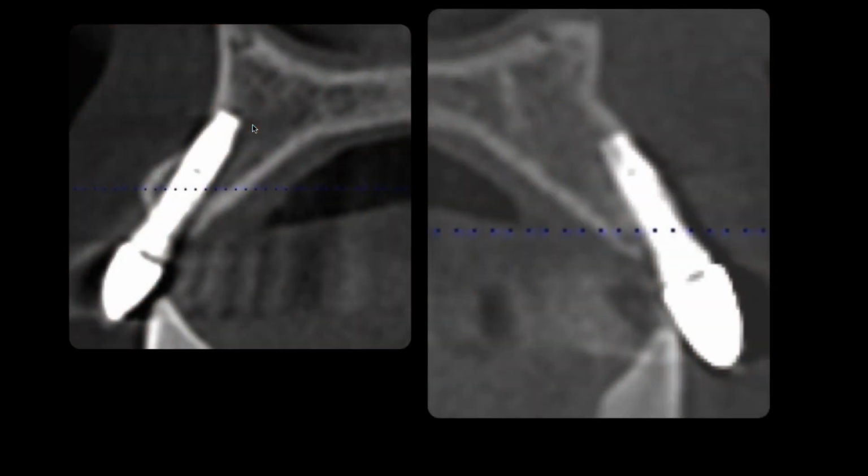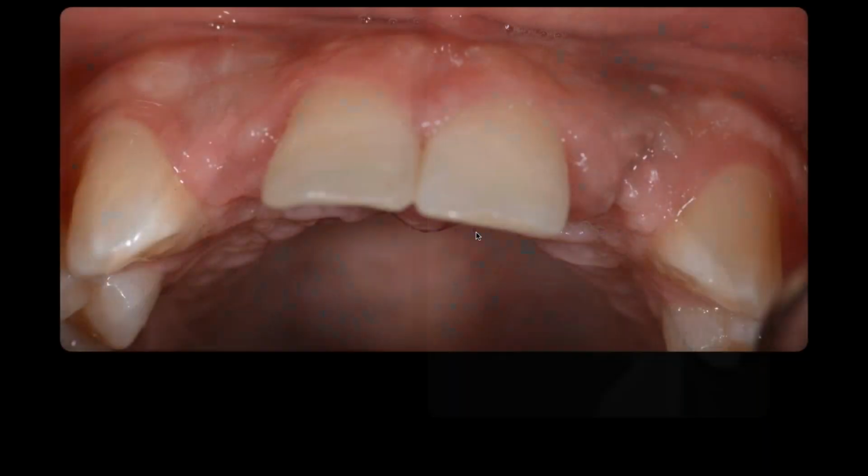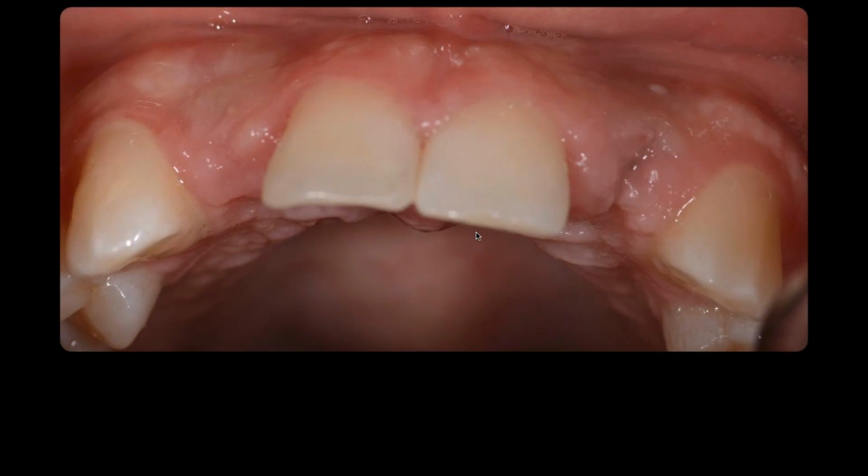All right, so we look at the scan. You see, obviously, these implants are too superficial. They're not deep enough, and they're too far labial, especially the one on our right screen. So I don't know how to save that otherwise. So we take everything off over the abutment, put cover screws on, let her just sit. About 8 weeks later, we come back, and now she's ready to have surgery. This is a nice way of doing it. If you jump in right away, you're not going to notice the soft tissue. So let the soft tissue heal up and close the wound.